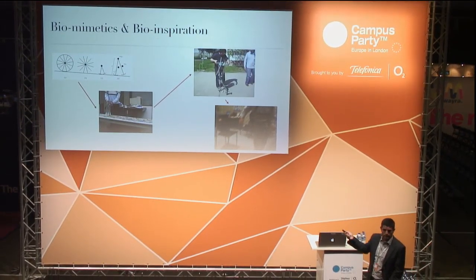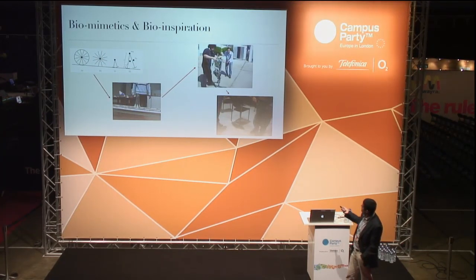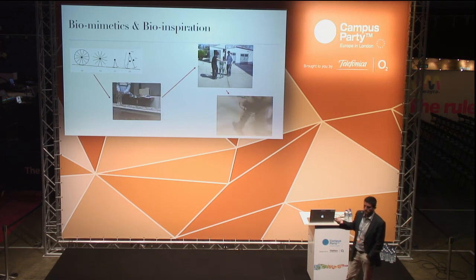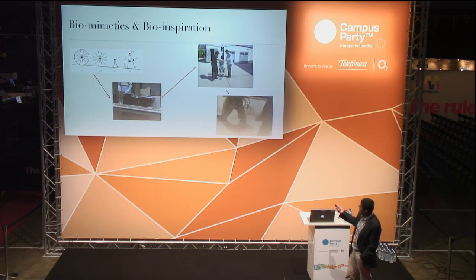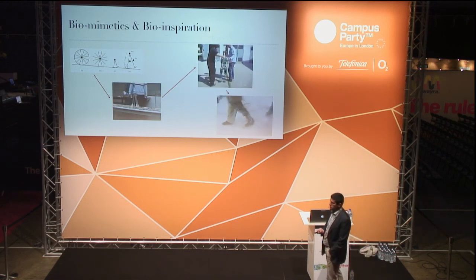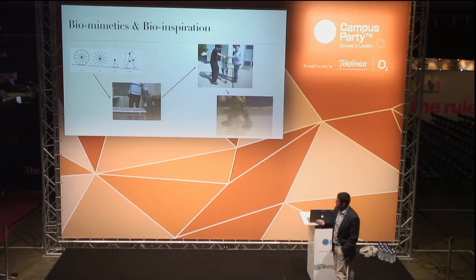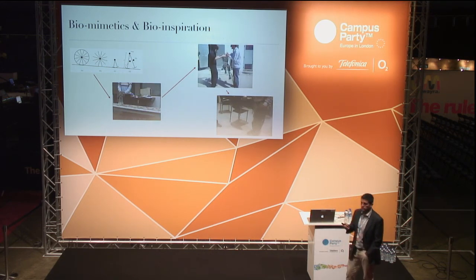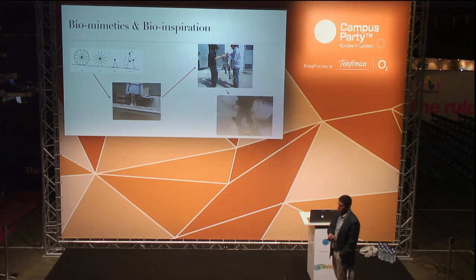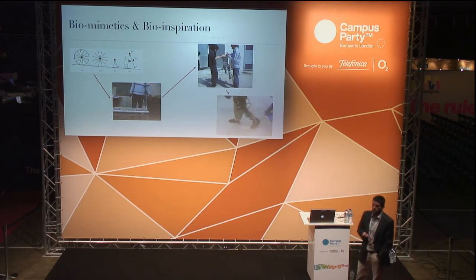And once we have demonstrated this with bipeds, then we move to the integration of these technologies into robotic exoskeletons to be able to be used as a system for functional substitution. And this is the particular case of a previous project that we had, where we were targeting patients with unilateral lower limb disorders. In particular, this patient here had a post-polio syndrome.